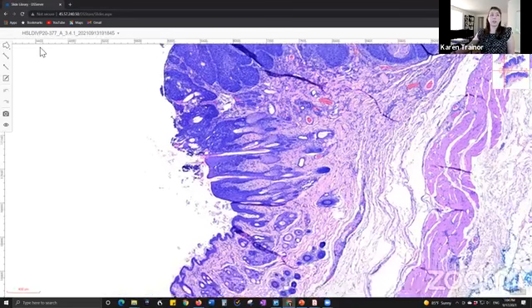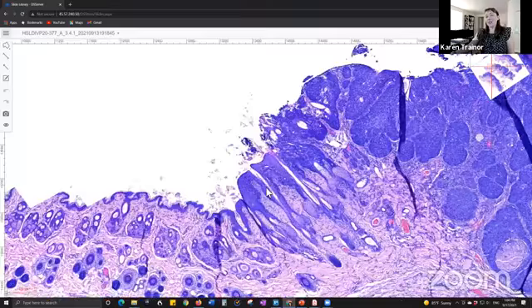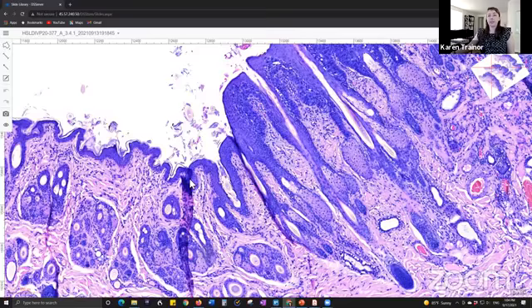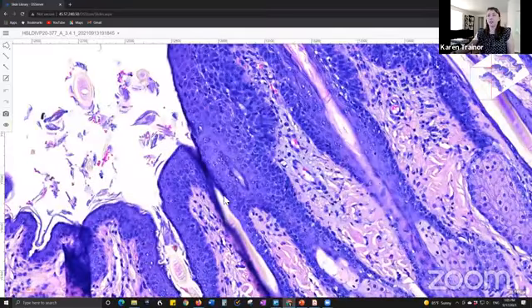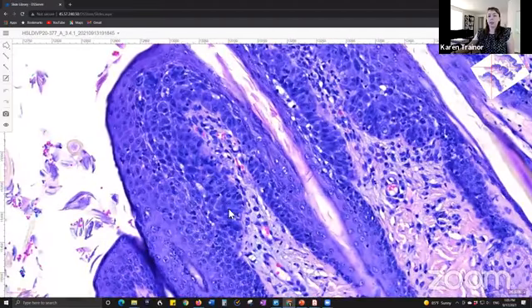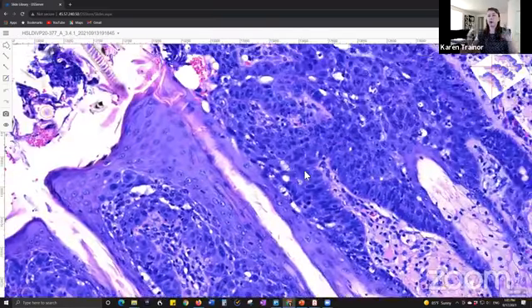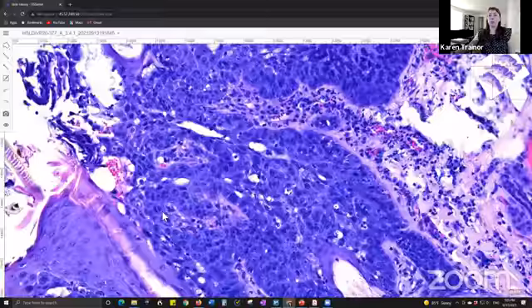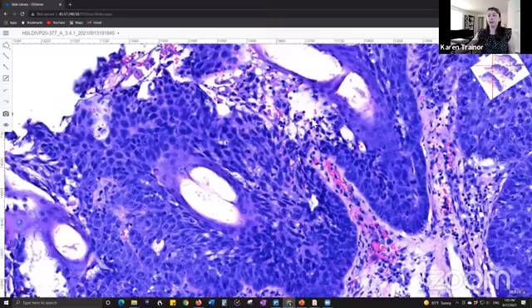If we look here, I'm going to rotate this so we can get our bearings. Some people like to look at a properly oriented slide. As we go from the normal epidermis, we're cruising along, then you can see it starts to become thickened here and extending down into the follicular epithelium, and it becomes progressively thicker, and then things start looking even more odd as we get closer and closer towards the mass. What happens here is we're starting to get mitotic activity slightly above the basal cell layer. We can see that the cells are starting to pile up, jumble up, and get very disorganized. So we're starting to see dyskeratosis. We've lost that normal orderly maturation process, and cells become jumbled.